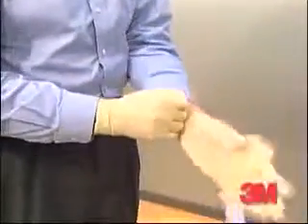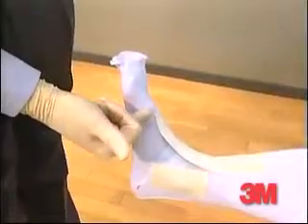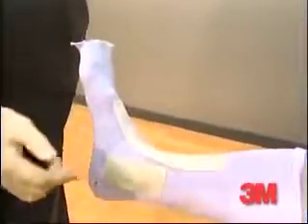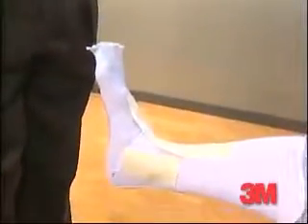As before, gloves are used for the application of the soft cast. And we will dip this in water because it's a very rapid wrapping technique. So we're going to start wrapping at the metatarsal heads, and we're going to continue up. And then when we come back, I'm going to alert you that we're going to do a heel lock on both sides of the ankle for stability.